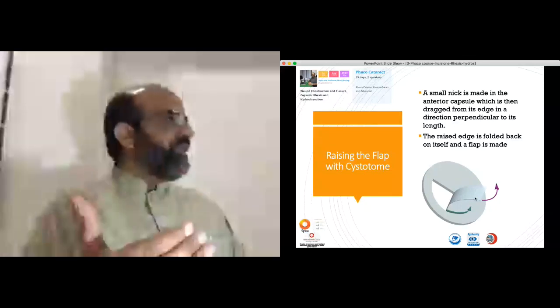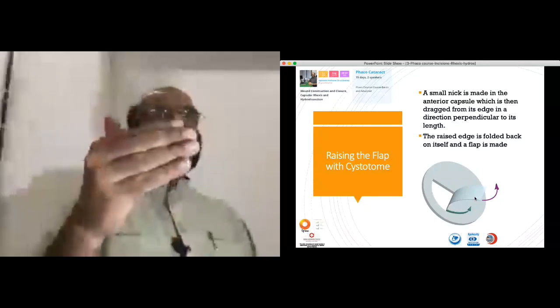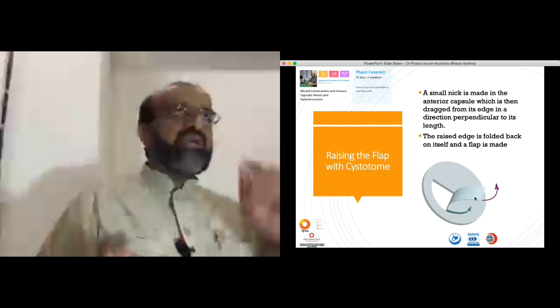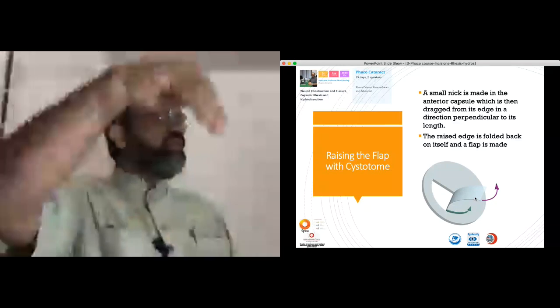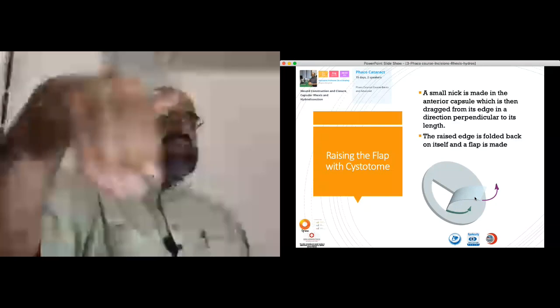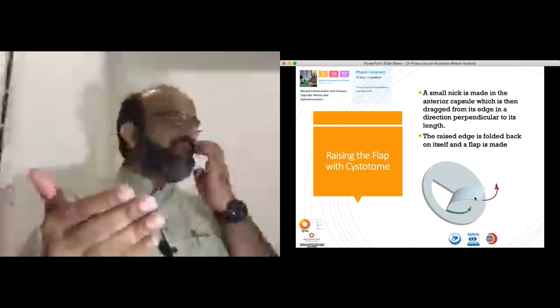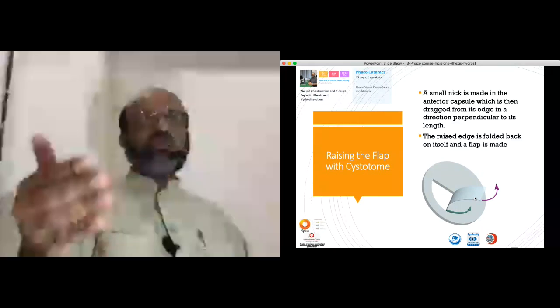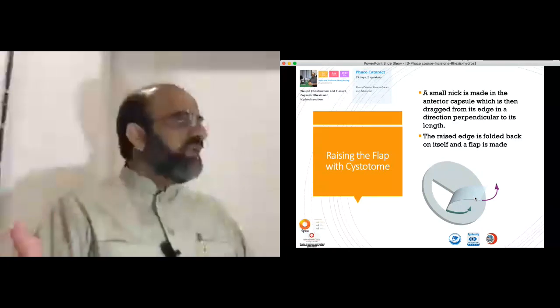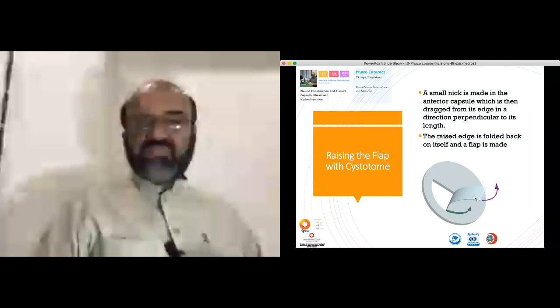capsular flap, not on the main capsule itself, because sometimes during pushing and pulling of this flap and completion of this rhexis, even in experienced hands, you can puncture it. And if your cystitome is handling the capsular bed, then a catastrophe can occur.